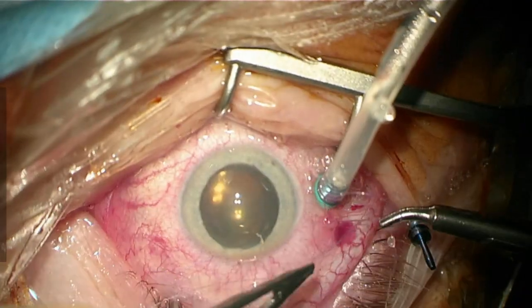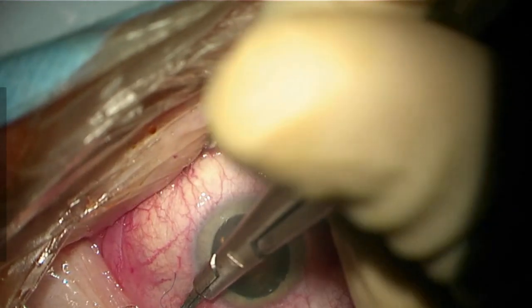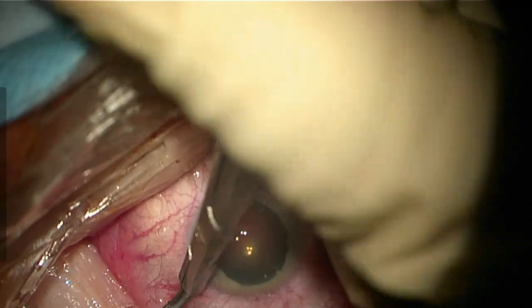For complete tamponade, it's essential to have a thorough vitrectomy with a complete air-gas exchange and perfectly watertight sclerotomies to avoid postoperative leaks.